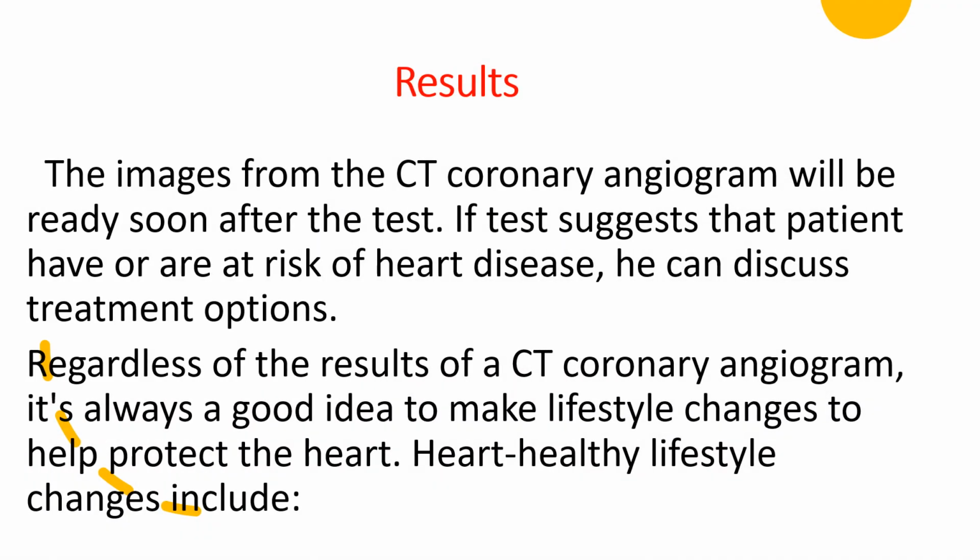The images of the coronary angiogram will be readily available once it is completed, so that the doctors can discuss how much area is narrowed or blocked. Based on that, they will plan for further management.